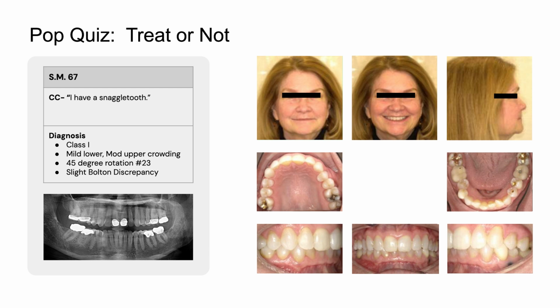Sorry, we don't show enough of a retracted view with these photos here, but we can get just that upper first molar, see how things are fitting together. Happy with that. It gives us an idea of what we want to accomplish, and one is not to have to change or move the bite. So I can rotate those teeth.